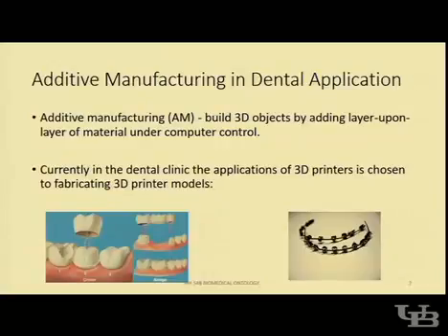And the CAD/CAM system has been used in dental applications before, but another process that uses the CAD/CAM system is a subtractive process, such as CNC milling or CNC machining, where it becomes wasteful because they need to have a solid block of material, and they remove the material from there. So it becomes wasteful, and it also lacks complexity, whereas the additive manufacturing process can produce any shape.